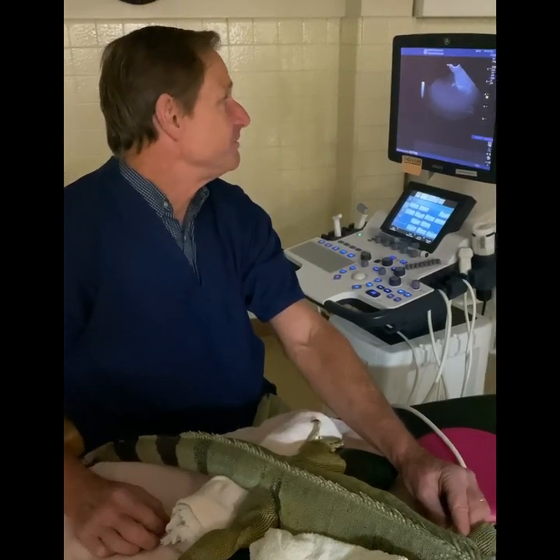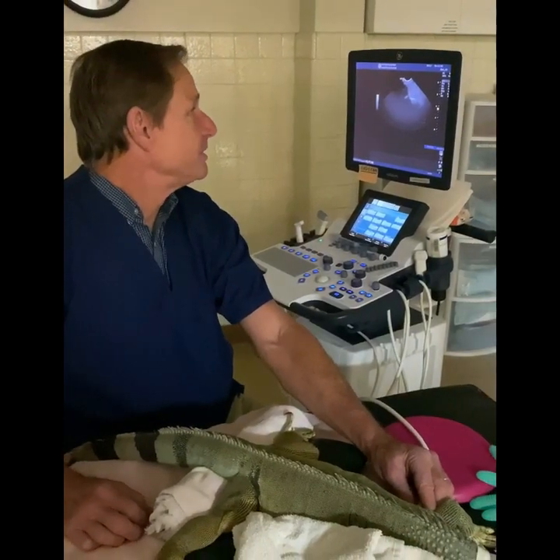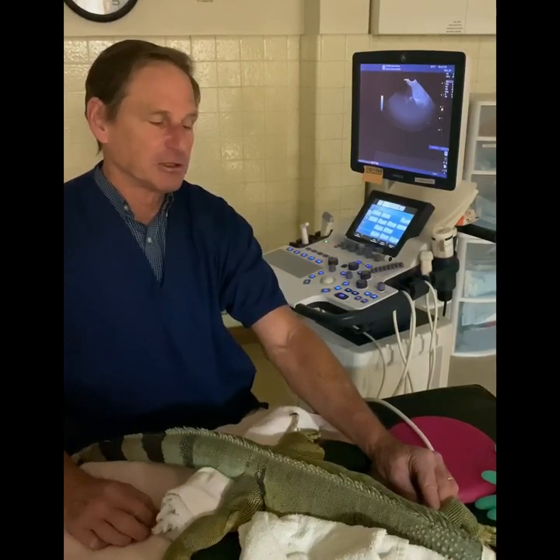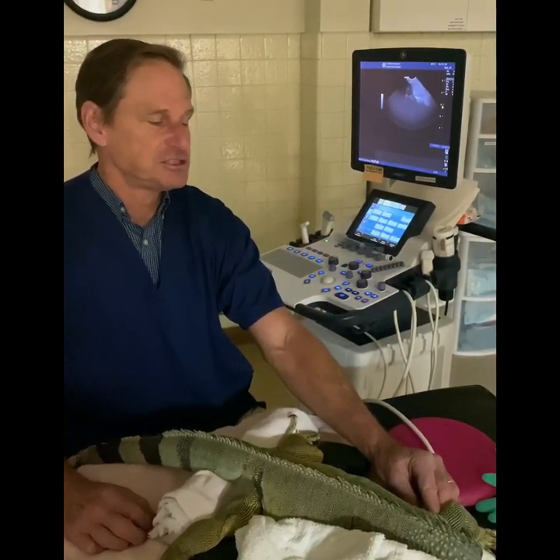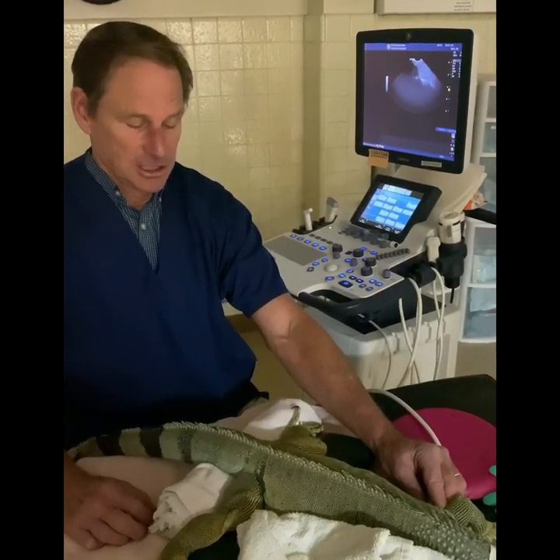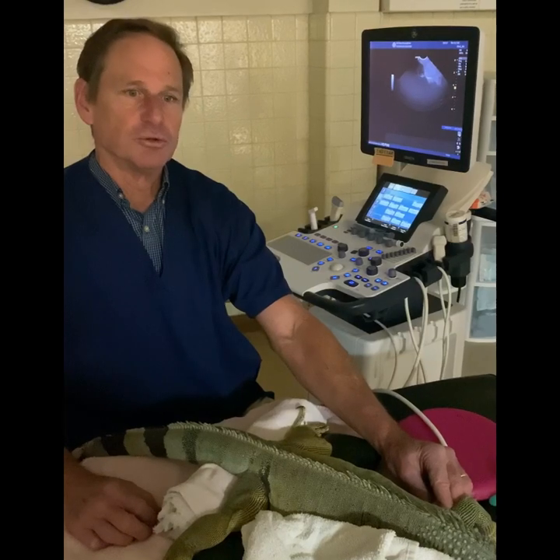We're monitoring his heart visually with the ultrasound probe at the moment. Sometimes we're able to get it with a Doppler, but right now it's showing up very nicely with the ultrasound and we'll use that as our main monitoring tool this morning.